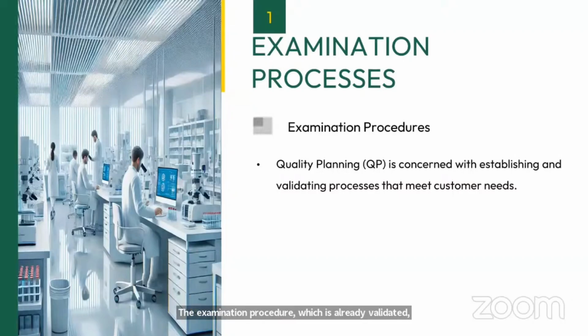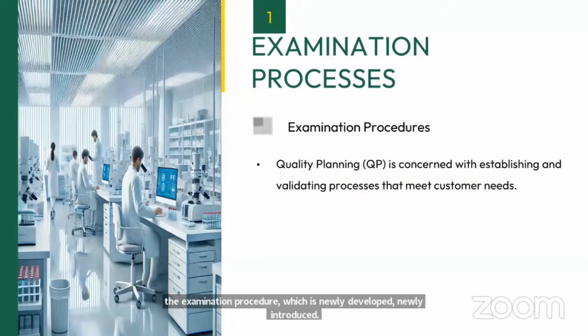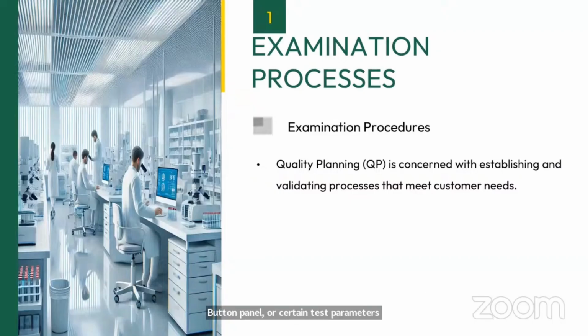And the examination procedure which is newly developed, newly introduced, where certain panels or certain test parameters are newly introduced. When you introduce these new parameters, when you introduce this new procedure, that time you have to perform a validation. Suppose commonly what I am doing, I am using a test method of glucose estimation by GOD-POD method.